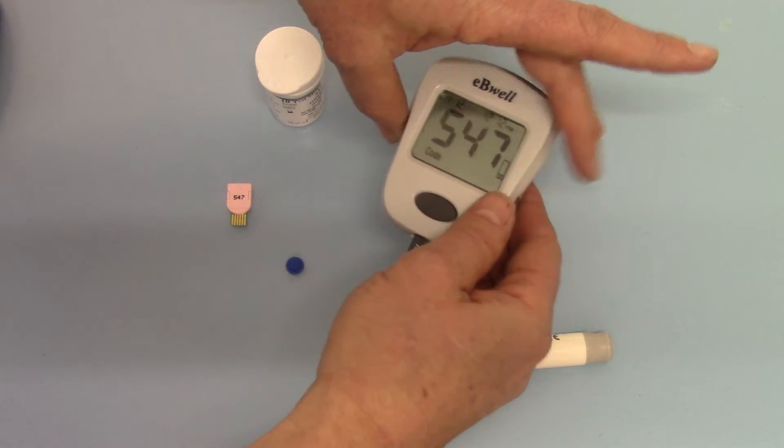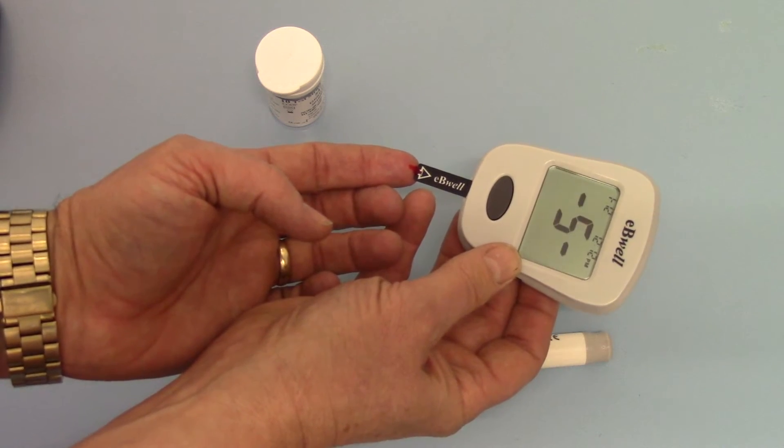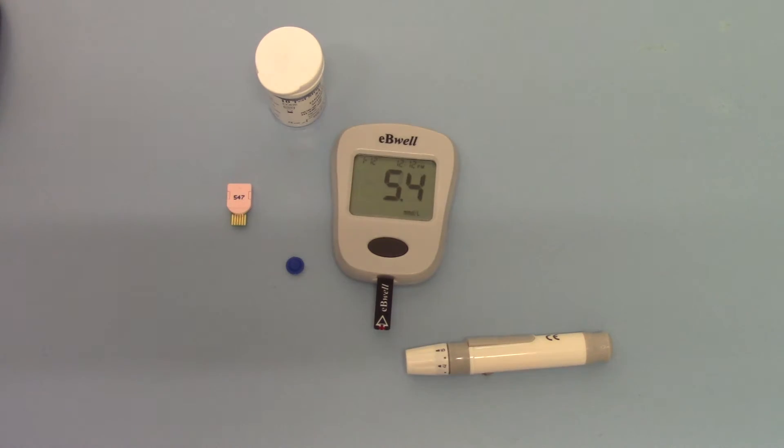To run the test you simply apply the blood sample until the meter beeps and then starts to count down. It takes about five seconds and there you have it. Your first blood glucose test result is 5.4 millimoles per liter.